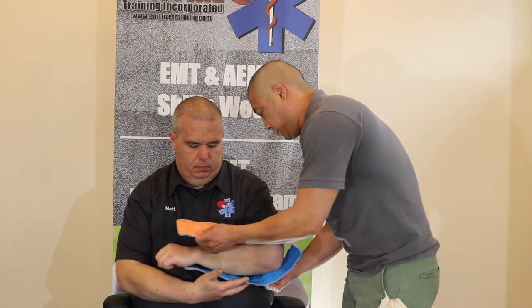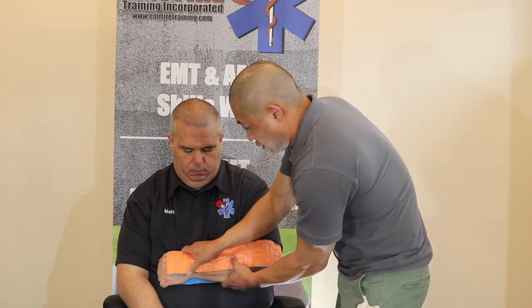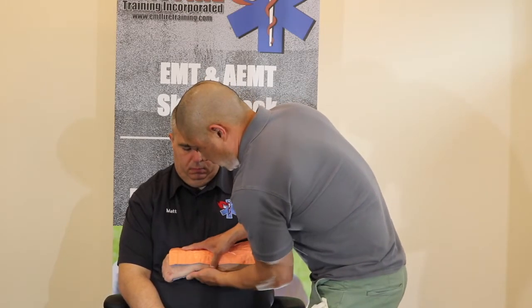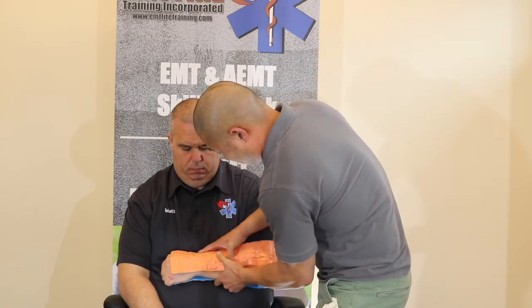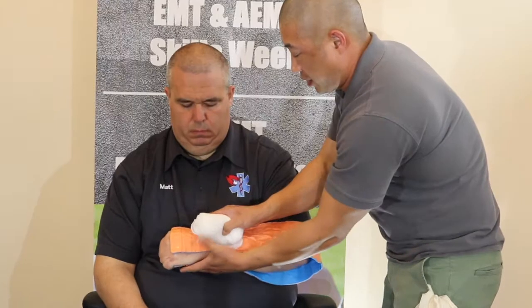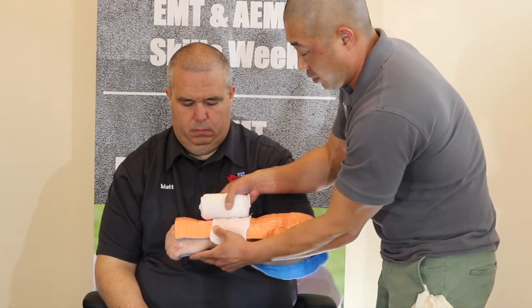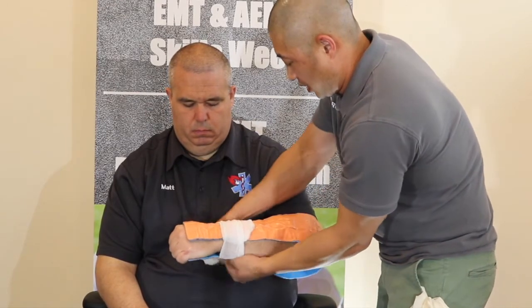The sugar tong splint is a good way to secure everything — one joint above and one joint below. It's going to go on the underside and lock up around his elbow. We're going to put curves in the splint itself to maintain structural rigidity. When doing this, it's not a bad idea to let the patient know it may be a little uncomfortable as we form the splint, since there may already be pressure on painful areas. I like to use Curlix to help secure it, holding the roll with the working end coming from the underside for better control.